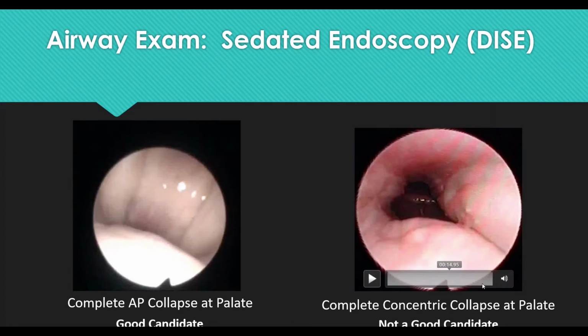Dr. Goss, do you have any kind of decision tree or any information about when you, as a physician, should choose Inspire over standard treatment? So standard therapy is always the best way to start with patients because they're new to the whole idea of having obstructive sleep apnea and what it means. It also gives them the discipline of doing something every single night, and they can see how that is involved and changes their lifestyle. And they learn how important it is to them.